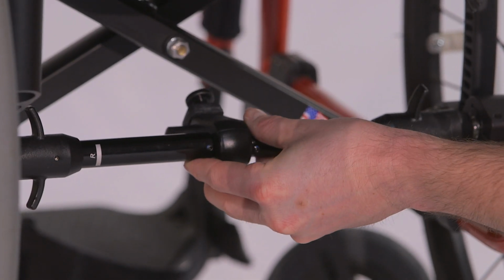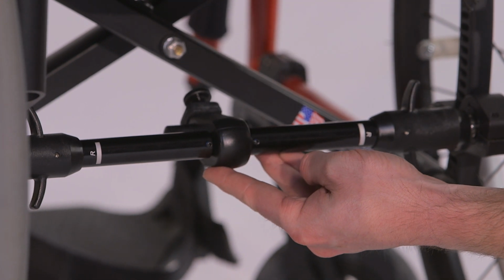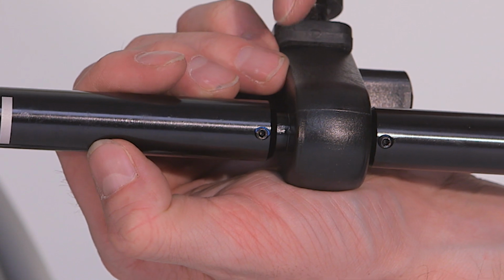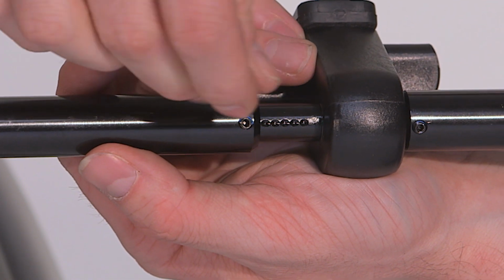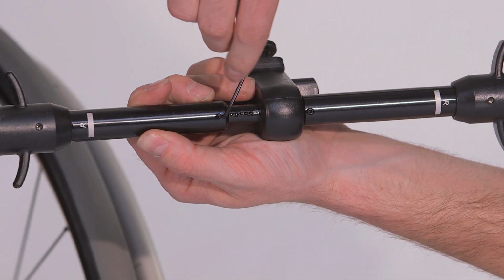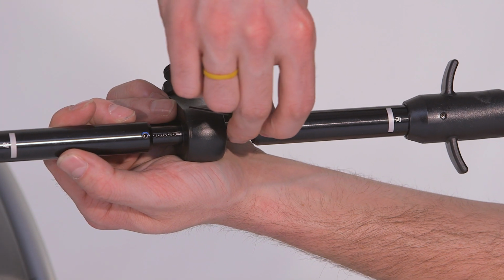Making sure the adapter attachment is centered, count the number of dimples showing on each side. For this wheelchair, there are no dimples showing. Removing the assembly from the chair, move the end tube so that 5 more dimples are showing on each side of the attachment than when you had it on the axle tips. Then, make sure to position the set screw in a dimple and tighten the set screw down. The same will need to be done to the other side.